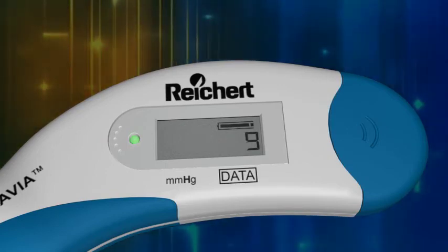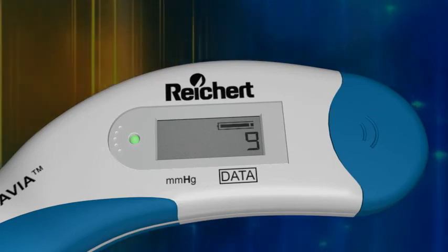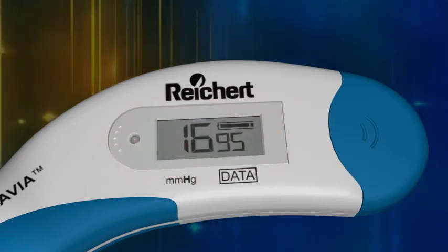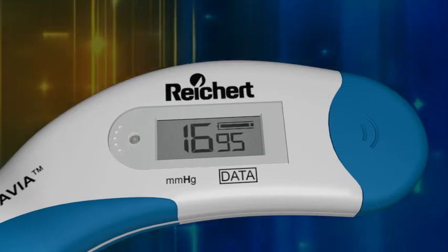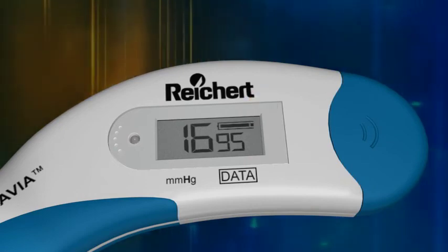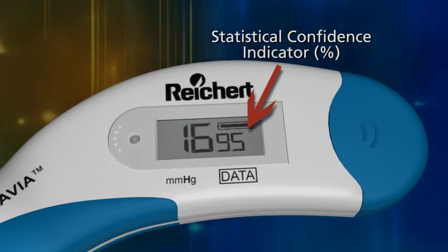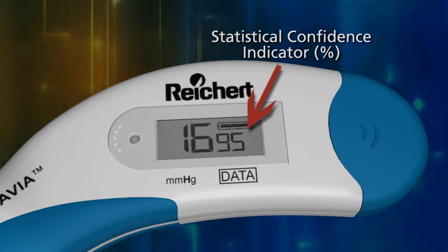After 10 readings are obtained, the device will beep and the LED will go out at the end of the measurement. The IOP reading is immediately displayed on the LCD. Notice the smaller two-digit number to the right of the IOP measurement — that is the statistical confidence indicator expressed in percent. The higher the statistical confidence percentage, the more reliable the reading.